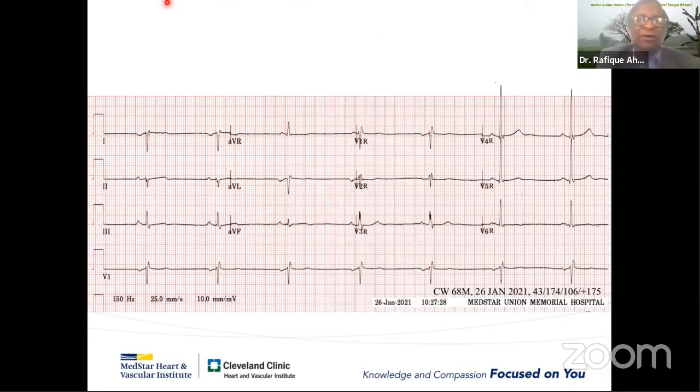So anyway, luckily these are not frequent cases, and this patient actually told me, Dr. Ahmed, my heart is on the other side, because he was not my patient. And I was doing cardioversion. Adult congenital heart.